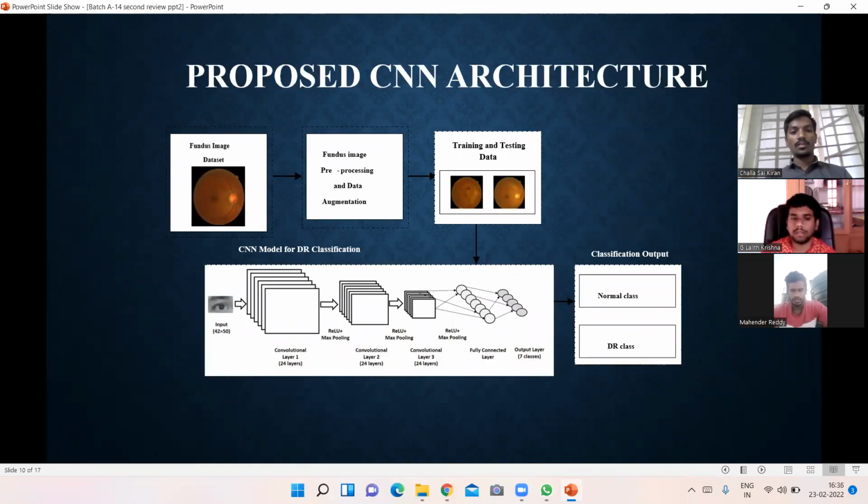After this, we use the ReLU function, which is a rectified linear activation function. The ReLU function will output the input directly if it is positive, otherwise it will output zero. After performing ReLU and the convolutional layer, we move to maximum pooling. Pooling is responsible for dimensionality reduction. So if we have 7 into 7 dimensionality, we will get a reduction to 3 into 3 dimensions.